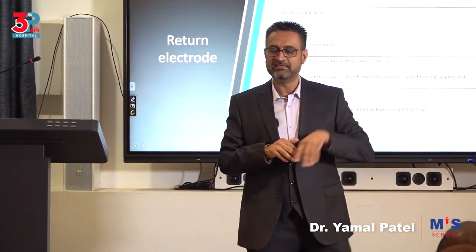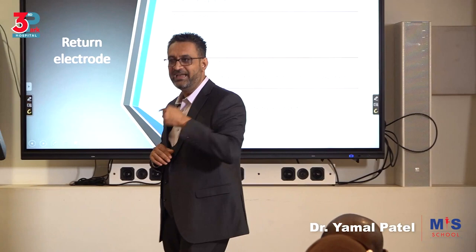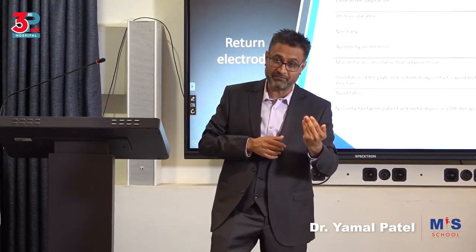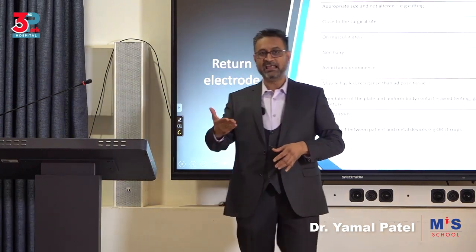But if it's wet with betadine, or wet with water, or wet with spirit, it has no electrolytes. So then it will create a barrier. It will not burn, but it will create a barrier and therefore not enough contact, and therefore you'll have a problem. You understanding? So saline is not a problem, it's a friend in electrosurgery. It will disperse the electricity better. Okay? So if you have to wet it, use saline.